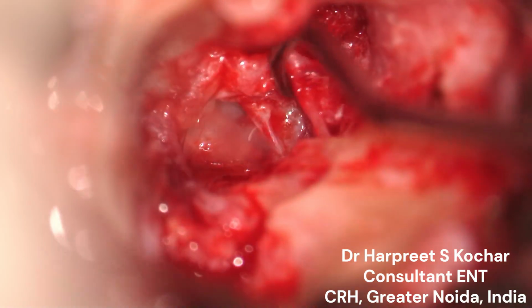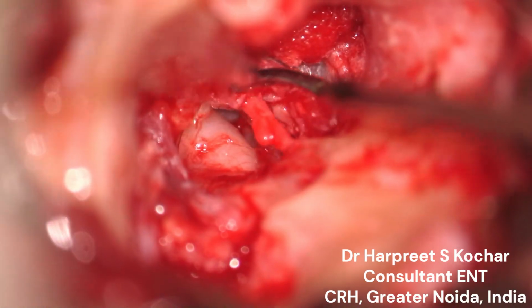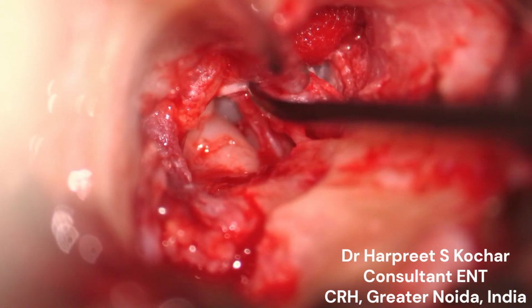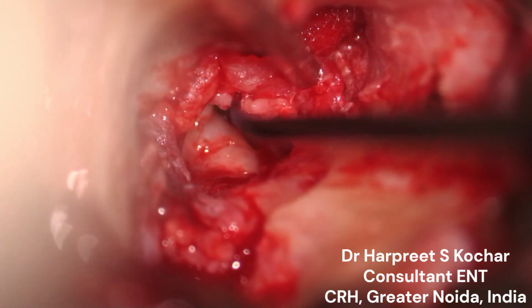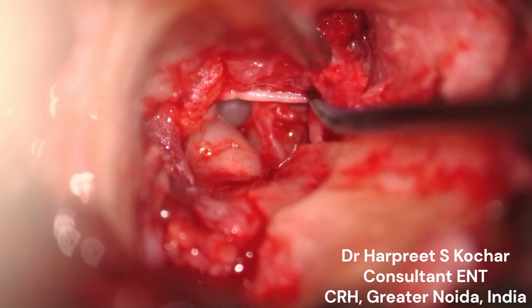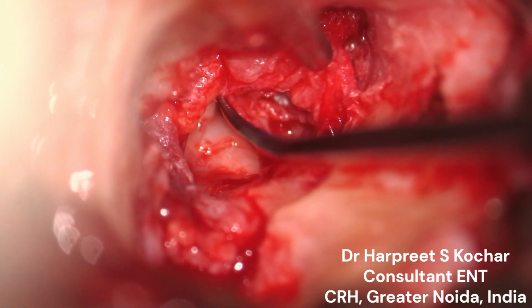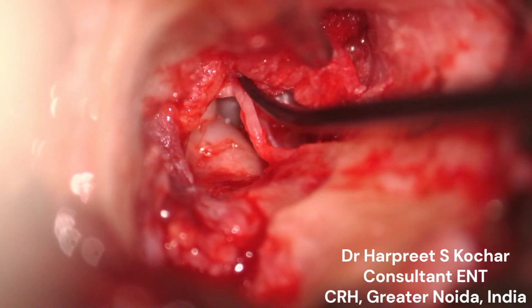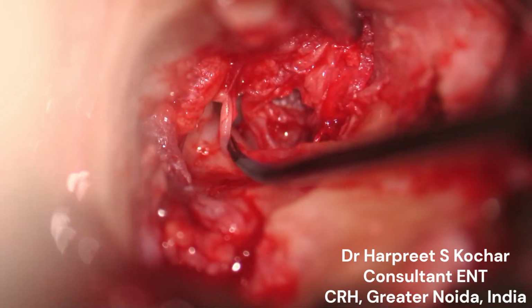The suprastructure is palpated to check for mobility. The corda is dissected from the disease, from the epithelium. Every effort should be made to preserve the corda, and in this case it is being dissected off sharply from the epithelium using a blunt curved needle. We can see the tensor tympani tendon coming into view in the 11 o'clock position.